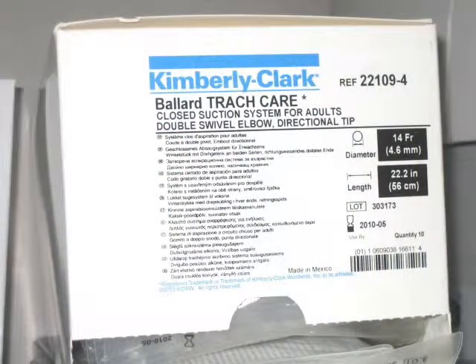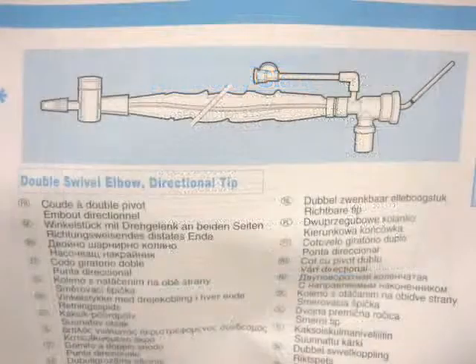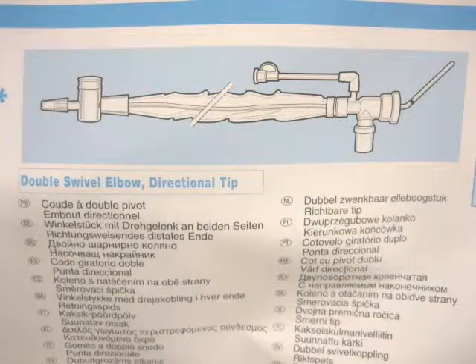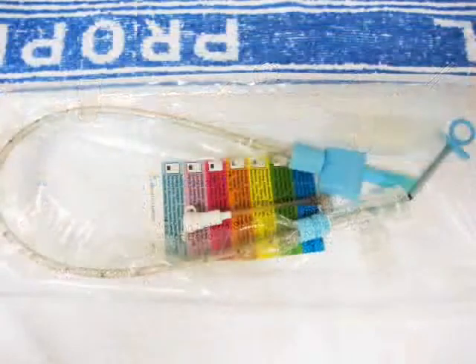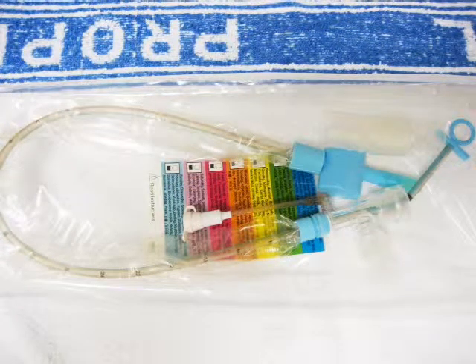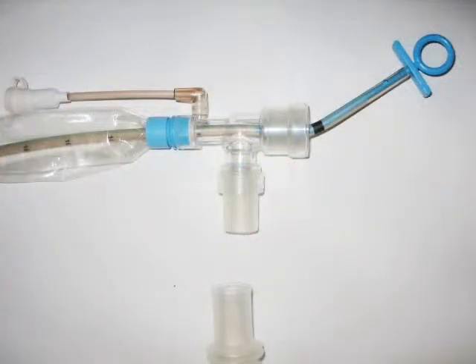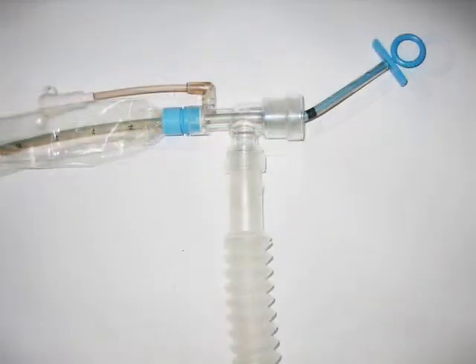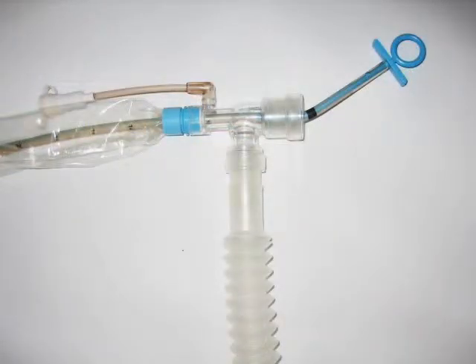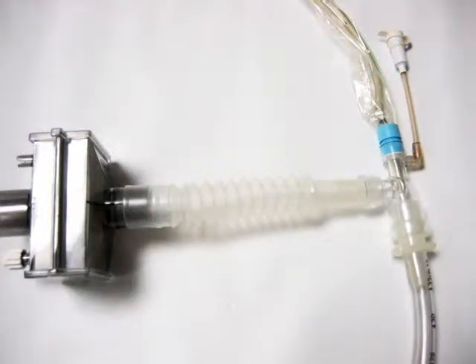Collect and assemble the needed equipment including the appropriate style of catheter, the appropriate size of catheter, and the appropriate labeling associated with the local policy and procedure. Ensure equipment is assembled in a sterile fashion and that any humidification or auxiliary devices are located properly.